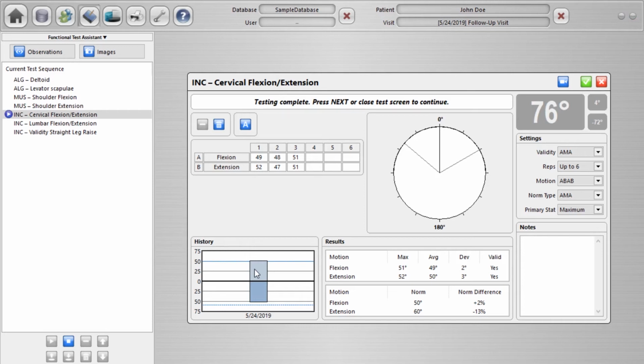And then, of course, this data would be carried over into any reports, any printouts. We have covered that material in some of our other webinars as well. But of course, all of this is very well and good, but the entire idea is that you can report that objective data with all of the calculations, with all of the comparisons of history, with all of the clinically significant findings against normal data. All of that is made possible by objective data.